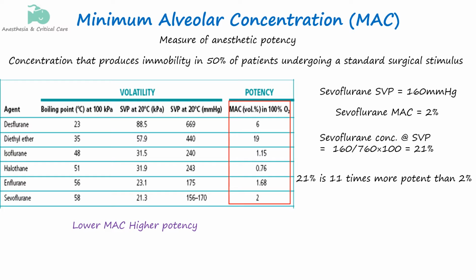Therefore, vapors must be diluted to provide clinically meaningful concentrations, and the way this is done is by mixing oxygen and other gases.